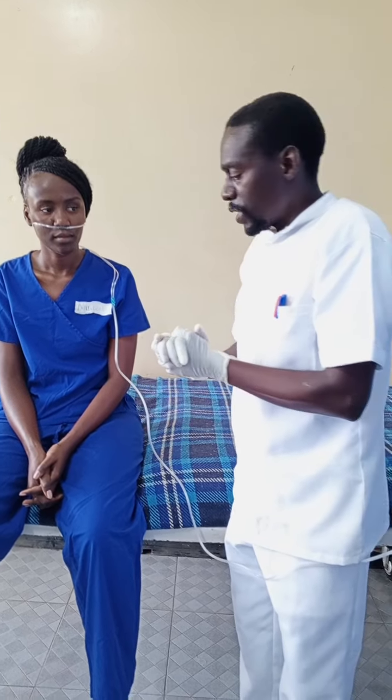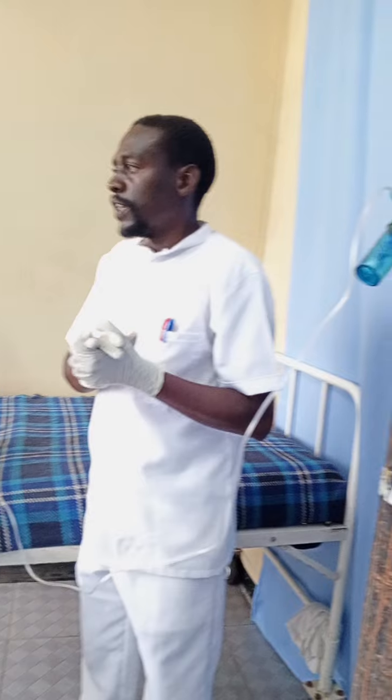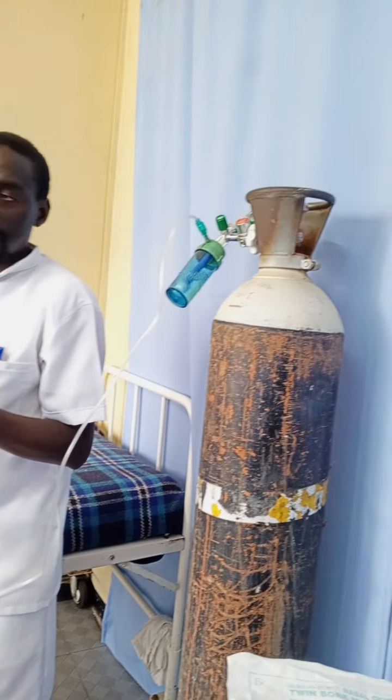If the saturations were low, you need to get a pulse oximeter and check the oxygen saturation. After that, you need to go and discard whatever you were using. Then report to the sister in charge.